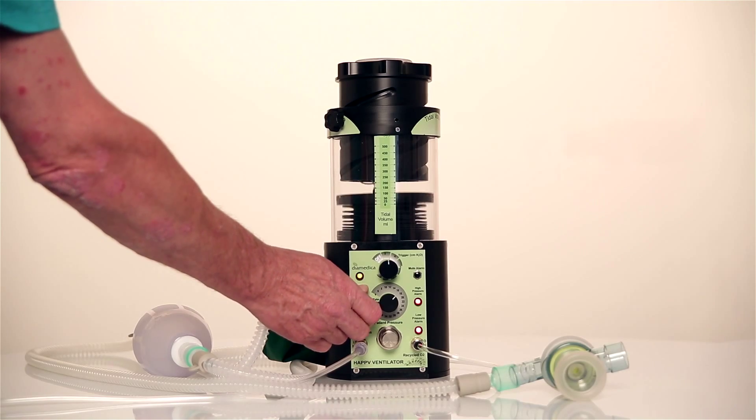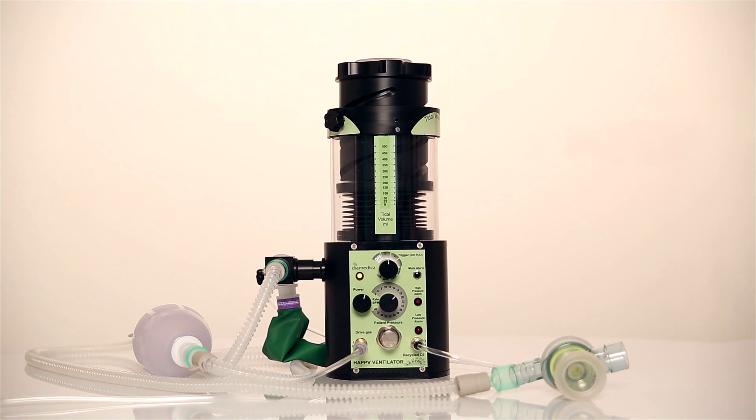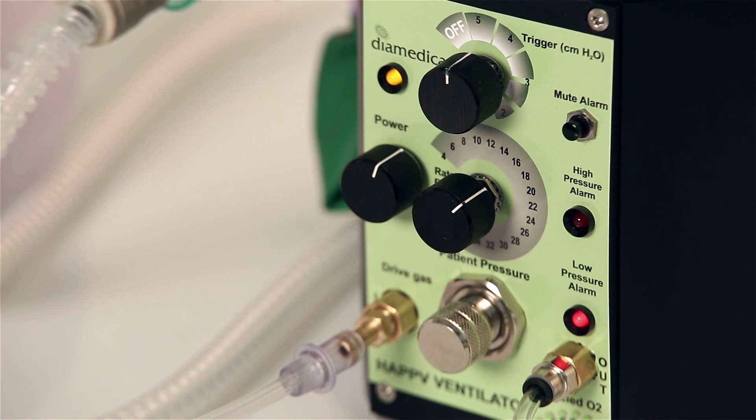When the ventilator is switched on, initially all three lights show and the low pressure alarm remains on until there is pressure in the circuit.